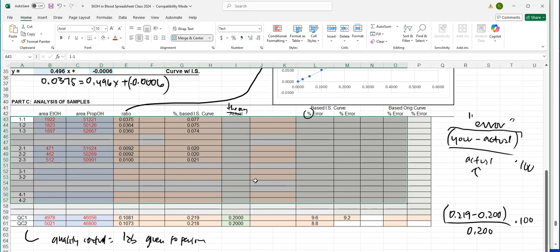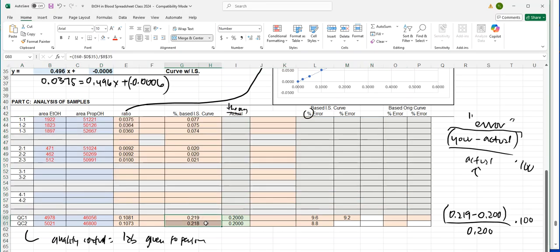In addition to that, it also makes me feel really good because we corrected for the headspace autosampler. Any autosampler would be treated this way, but with this autosampler, there are chances it slips up every now and then. So that's why we did an internal standard with this particular data.